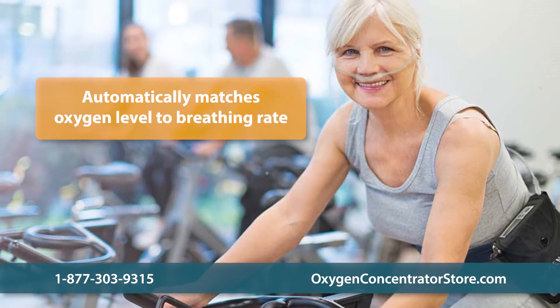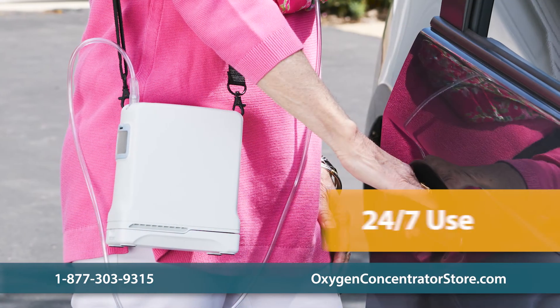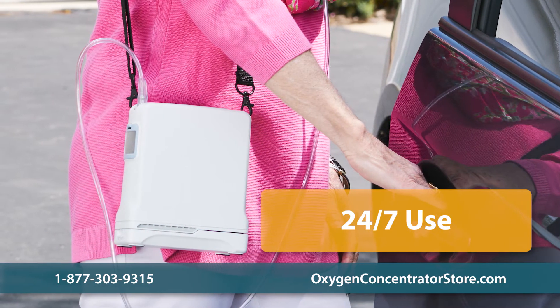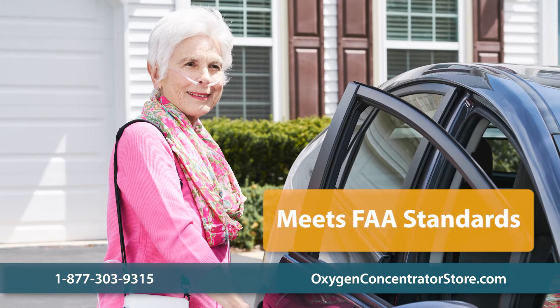The unit precisely detects breathing rate and adjusts oxygen levels accordingly. The G4 is designed for 24-7 full-time usage, can be charged at home or on the go, and meets FAA standards for airplane travel.